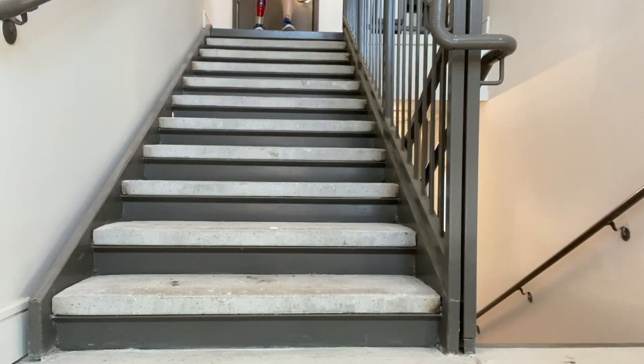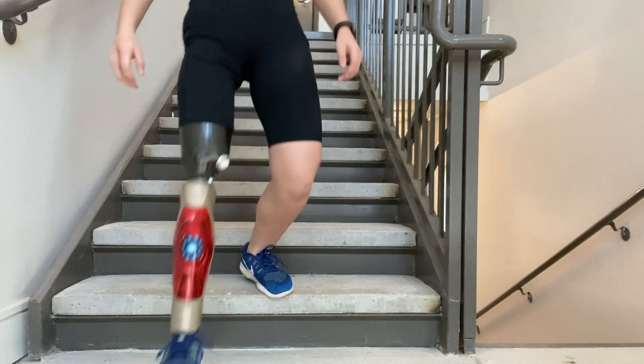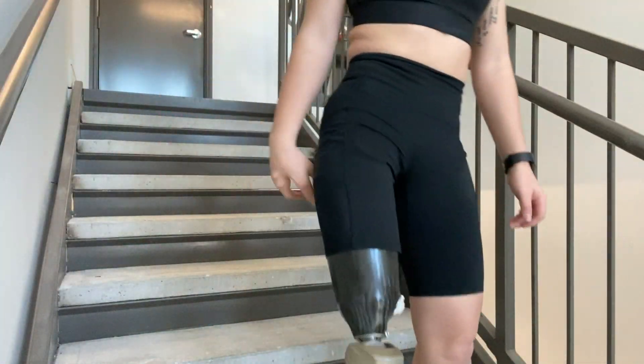In 2015, I got my C-Leg, which is the leg I currently have. Because it's a microprocessor, it has a computer in it that tells the leg everything it needs to know, including when I'm going downstairs so it can adjust accordingly. As you can see in these clips, I'm going down the stairs one over the other just like any other normal person. This was such a game changer. Being able to do one over the other just makes me feel so like a regular person, so it's super awesome and I really love it.